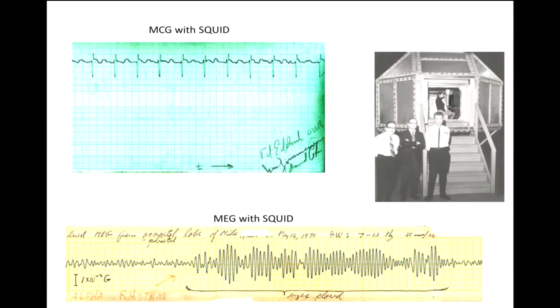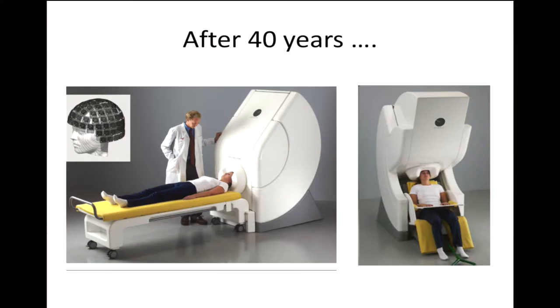That is right, yes. Let me see if I have a picture. Don't have a picture. That's right, pickup coils are placed on the scalp in a helmet.